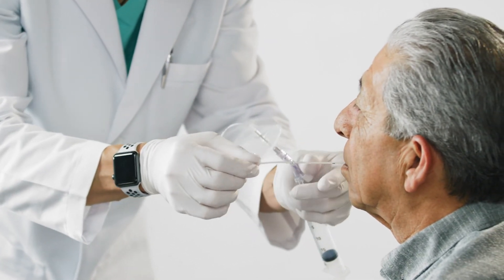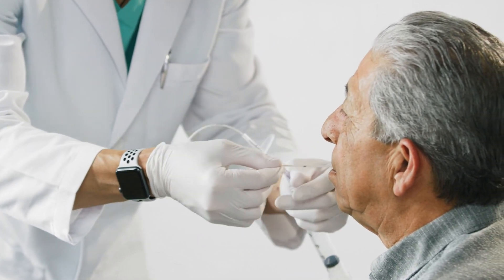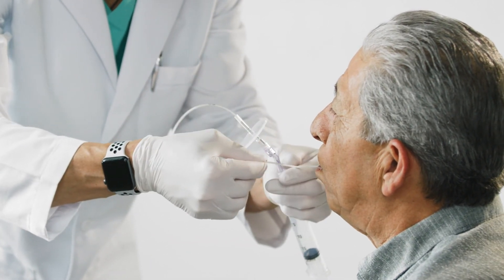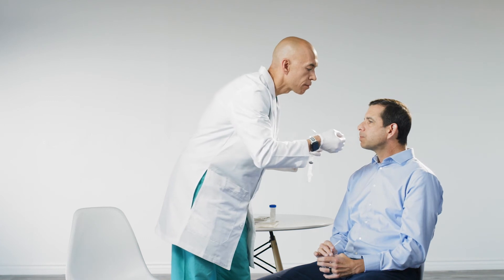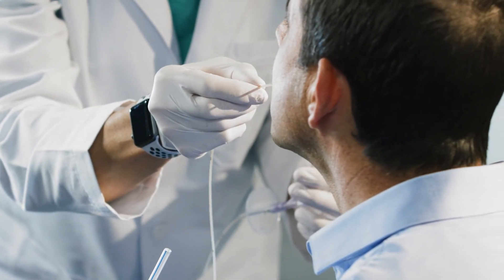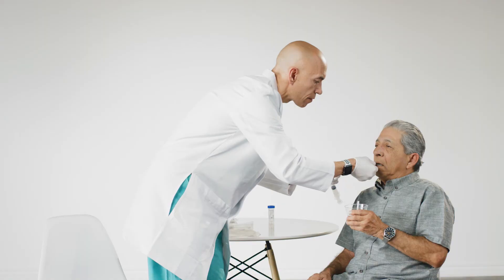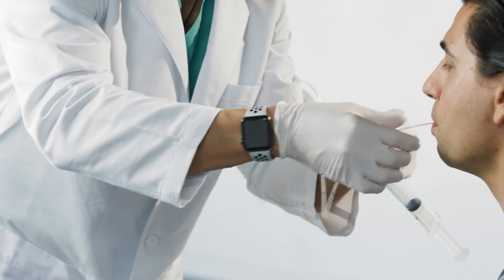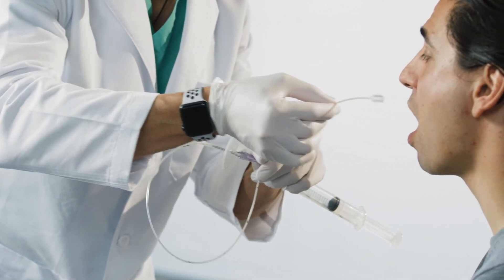With the cell sample protected, continue to withdraw the catheter in a retrograde direction. The capsule may create some resistance at the upper esophageal sphincter, which may require a gentle pull to extract the capsule. Ask the patient to swallow while simultaneously pulling the capsule across the upper esophageal sphincter. This will relax the upper sphincter and make it easier to extract the capsule. Once the capsule has reached the mouth, have the patient open their mouth and remove the capsule. Once removed, hold the capsule securely to avoid contamination.